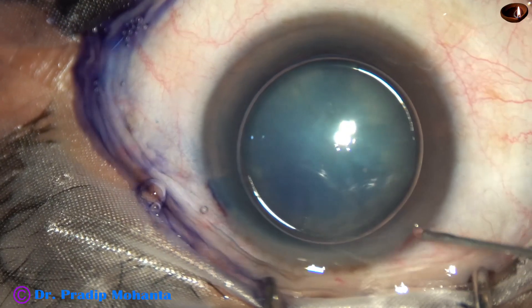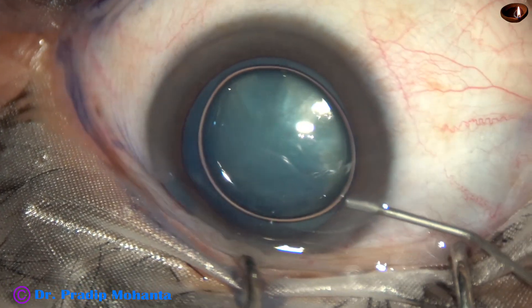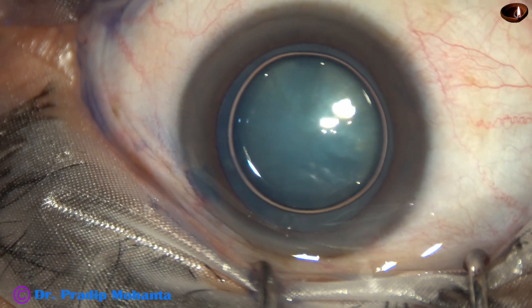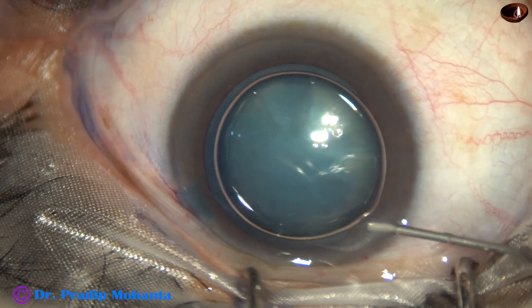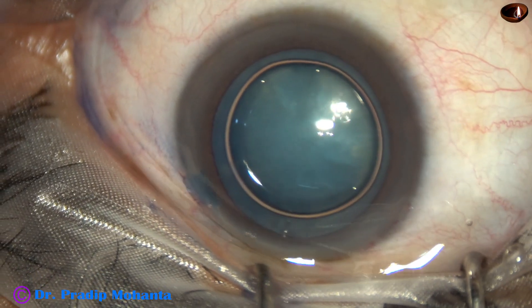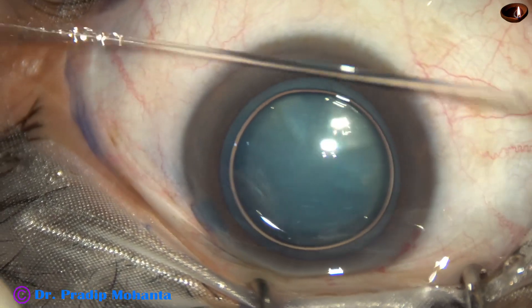Now this is phenocaine. The patient is under topical anesthesia and the patient is finding it difficult to cooperate.